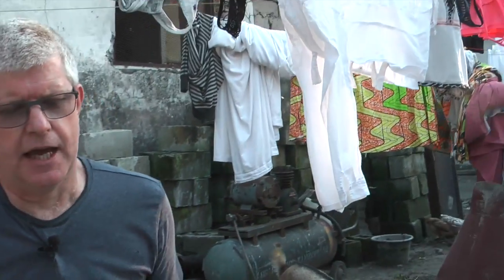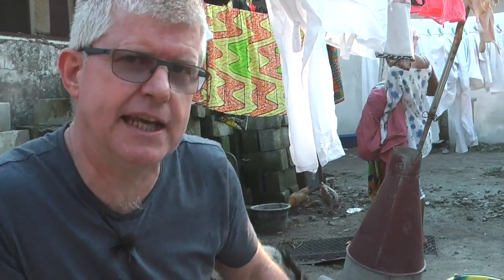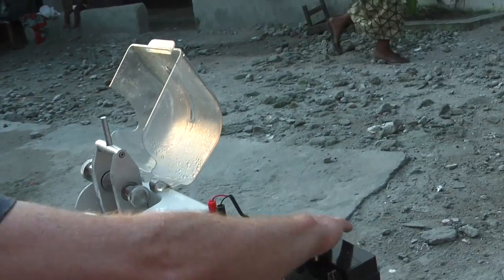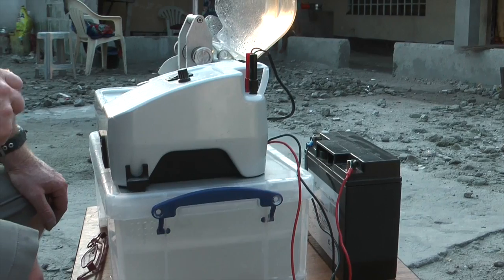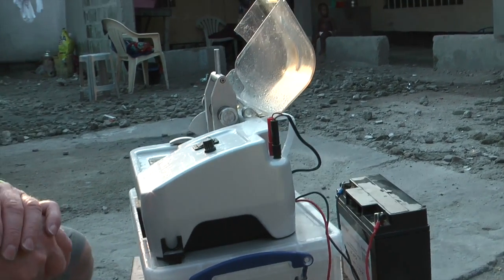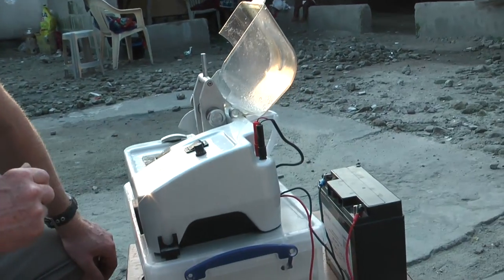We're just trying the machine out. This is its second trial run here in the Congo, and as you can see, the machine is very small. We actually brought it in as hand luggage on the airplane. It has a very small battery, which is 24 volt. You can use car batteries — just put two car batteries together and they would work. And these batteries can be charged using solar panels.